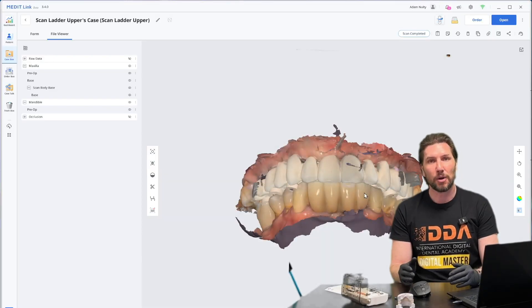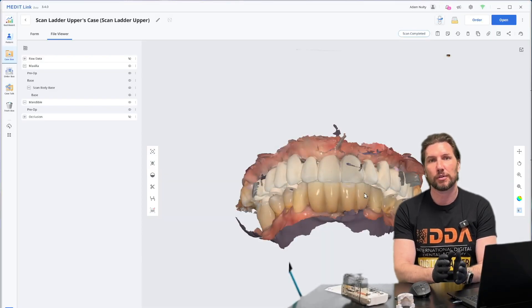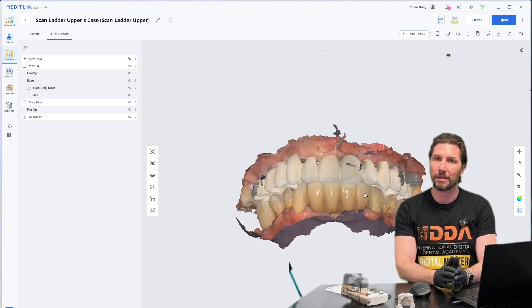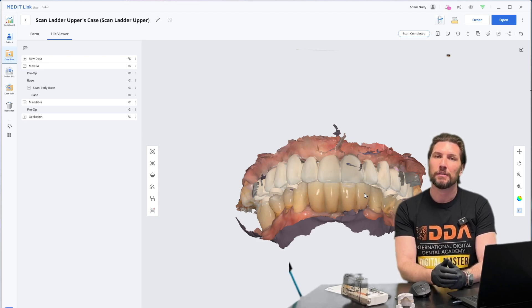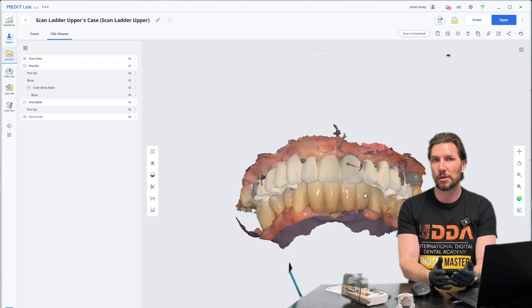Let's discuss how we export our scan data for the All-on-X case from MeditLink right into a folder for us to be able to use in our choice of CAD software.